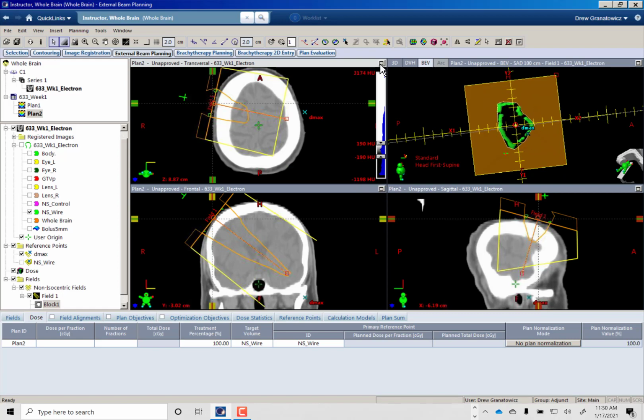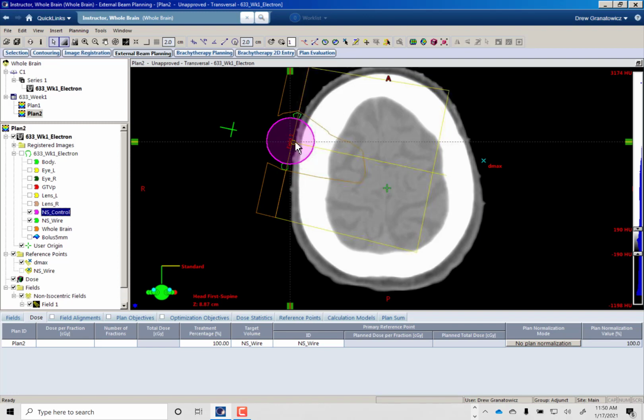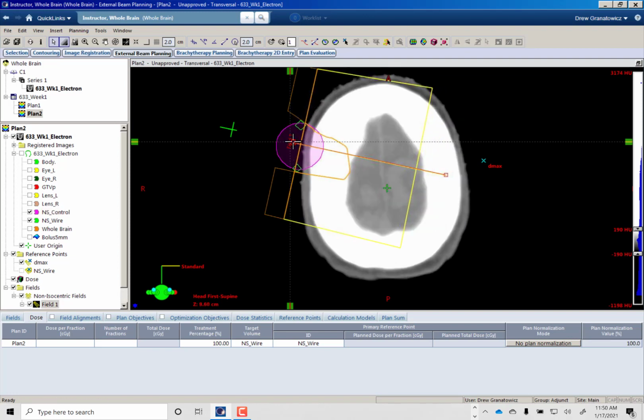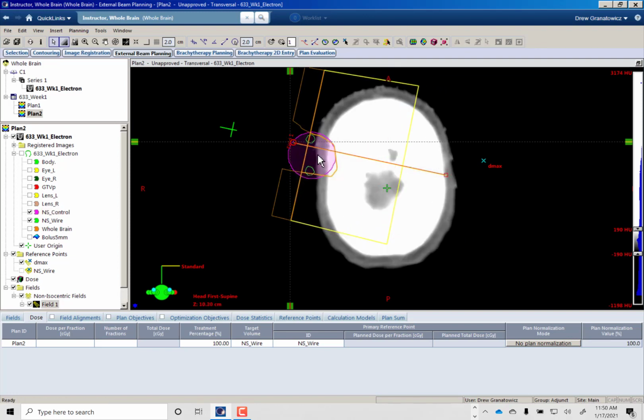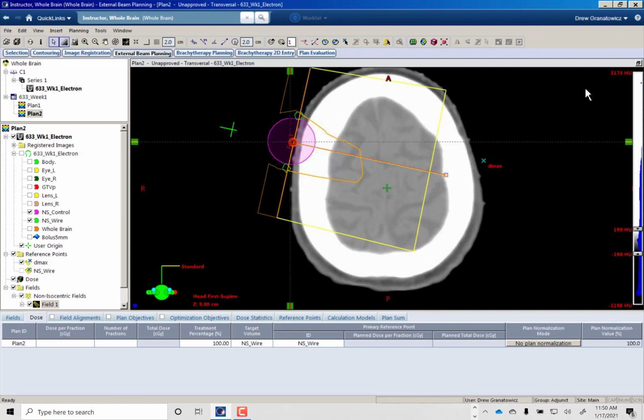So sometimes what I'll do is I made this contour, and this contour is 3 cm wide, a 3 cm diameter circle, and I placed that contour in the center of the wire, in the center of the field for the whole length of that wire.